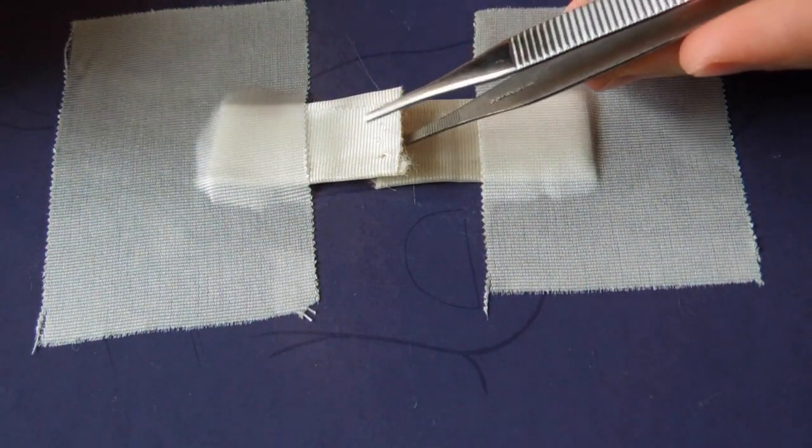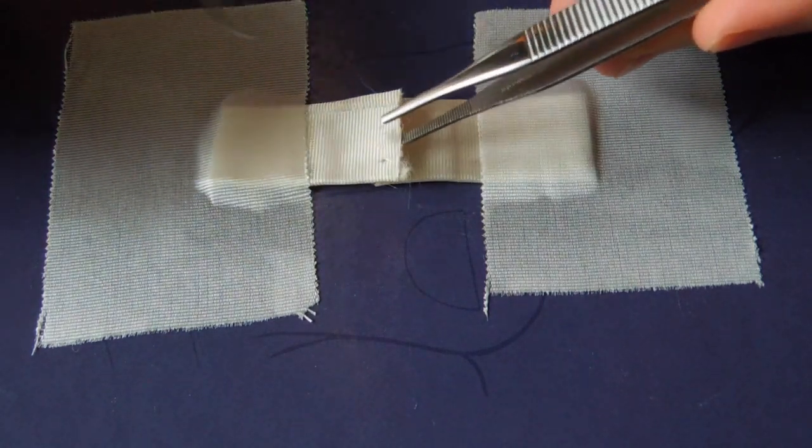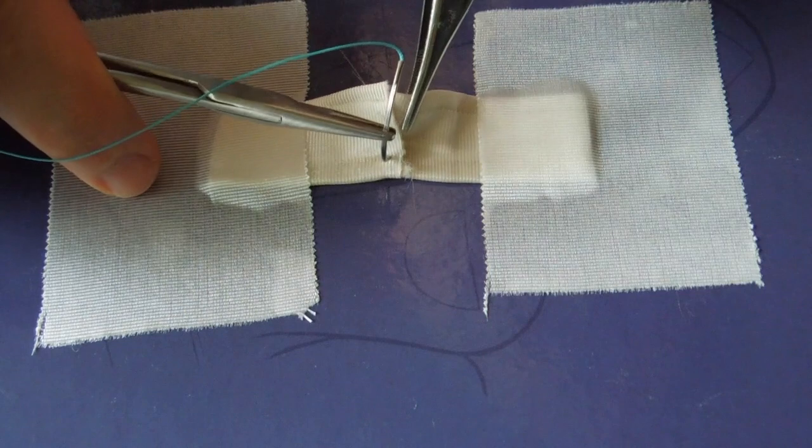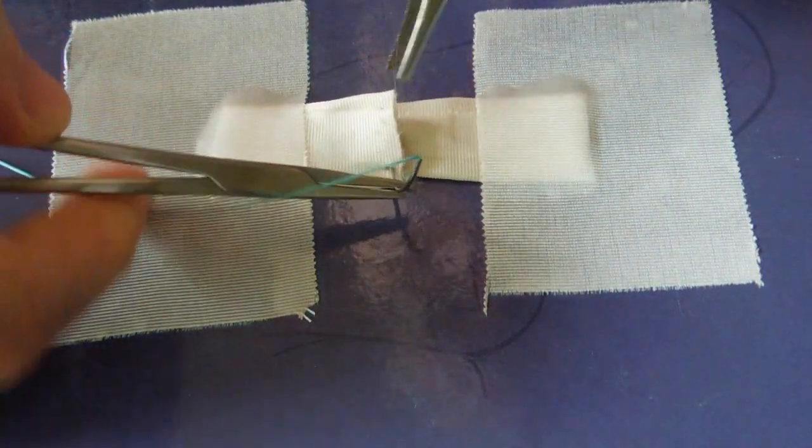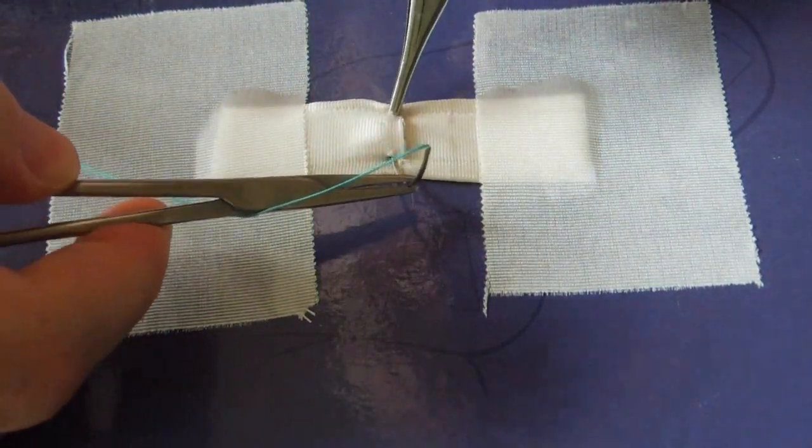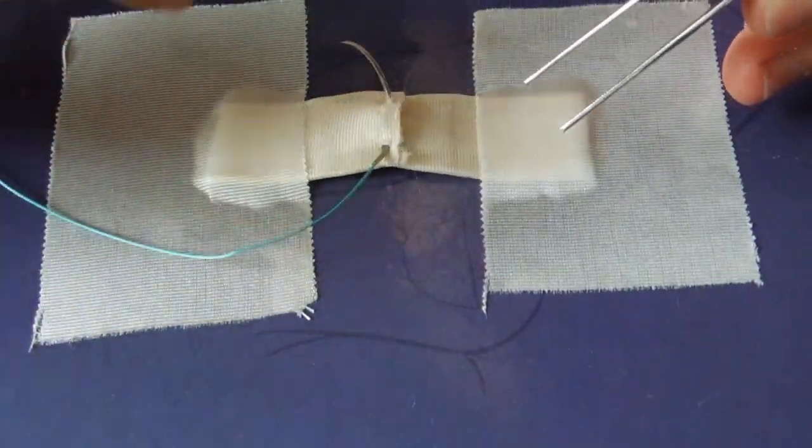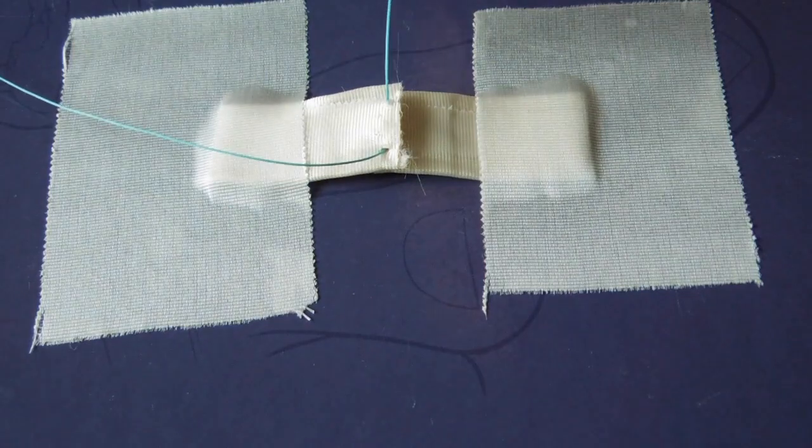We could turn this into a one-step process if we have all of our structures directly visualized. We could theoretically throw this in one throw of the needle. The problem here you can see is that my needle is too large to get close to that position of those throws, but we do end up with the same result.